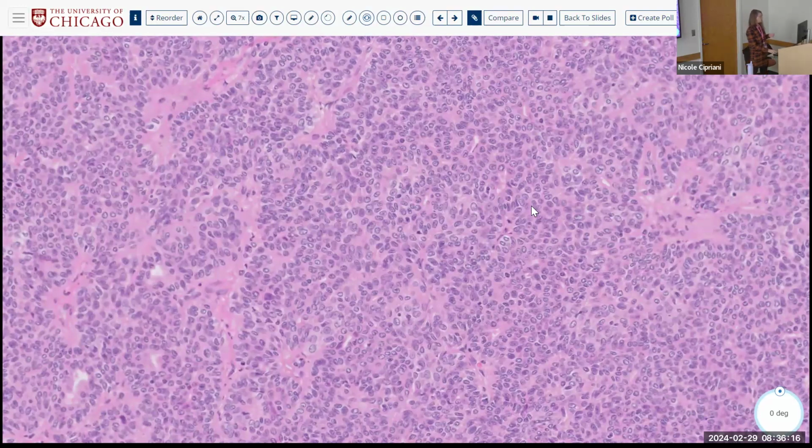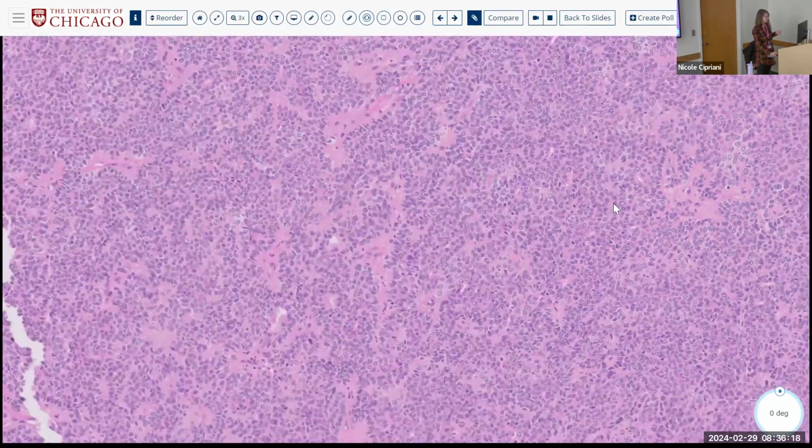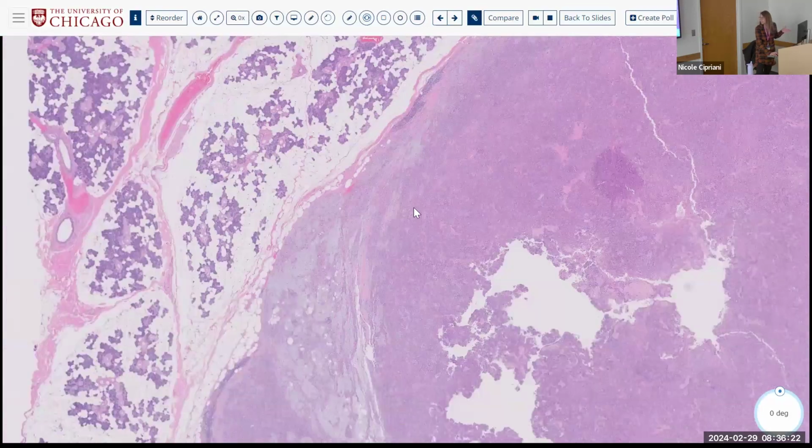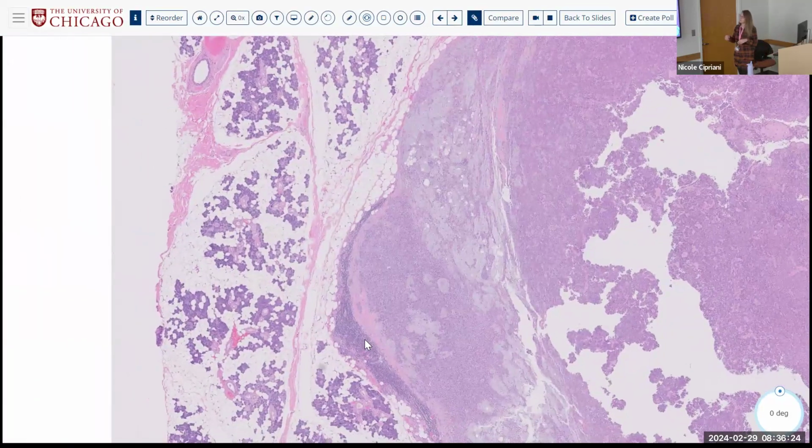But in that case, right, we allow a little bit of undulation of the borders of a pleomorphic adenoma, because these can have so-called pseudopods, right? And that nice myxochondroid matrix is very, very helpful. The biphasicness is very helpful, and the pseudopods are allowed.